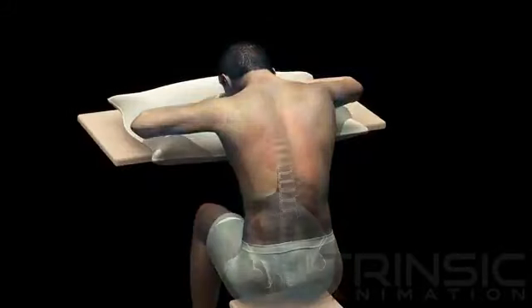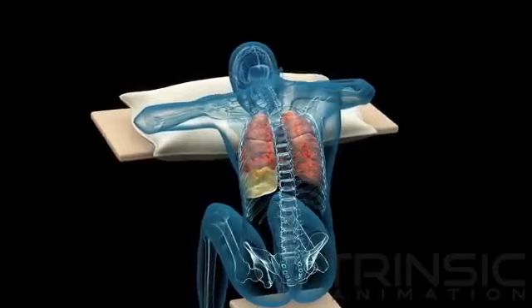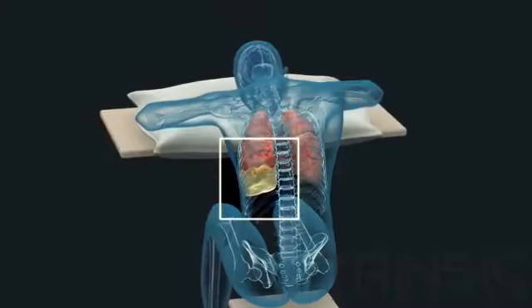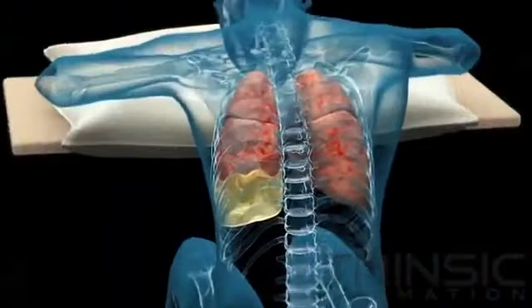Thoracentesis is performed to assist in the diagnosis and therapeutic management of patients with pleural effusions.